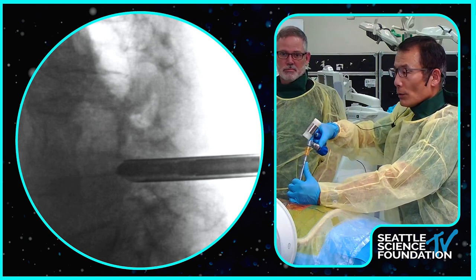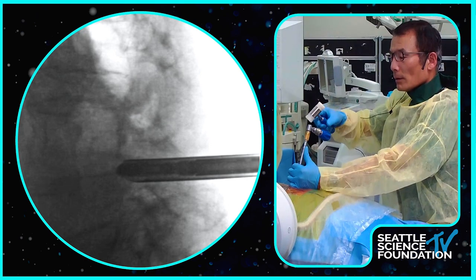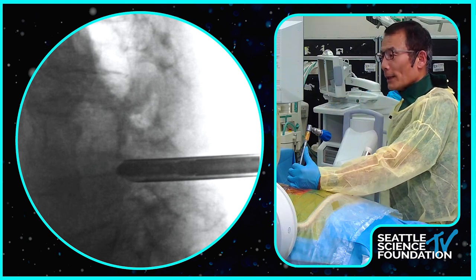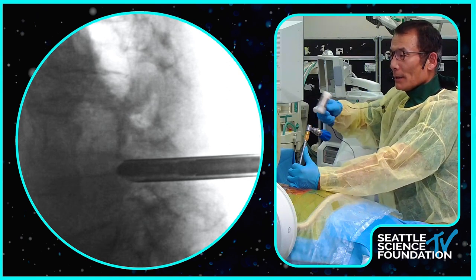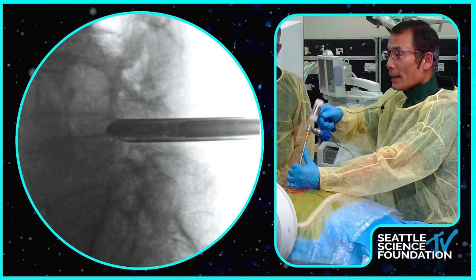And Shen, you mentioned before the concept of the ALL release. Are you just thinning it out? Are you doing a release? Because if you release it, there's concern of bone grafts migrating anteriorly. So what's your thought on that? Yeah, that's a great question. So there's a trick. I just use a pin field, puncture holes on the ALL, multiple holes, and then I rely on the expandable cage in there. Let it stretch anteriorly. So you're not making a big hole anteriorly, but you created enough release that it still keeps the bone graft. It's borrowing from the pie crusting technique in total knee. Exactly, yeah. The pie crust.